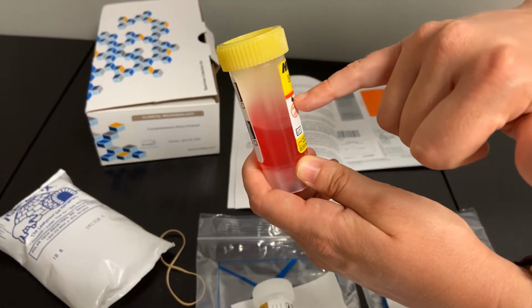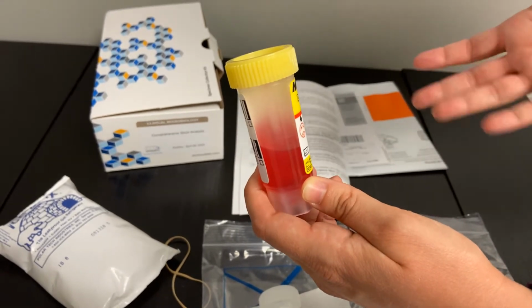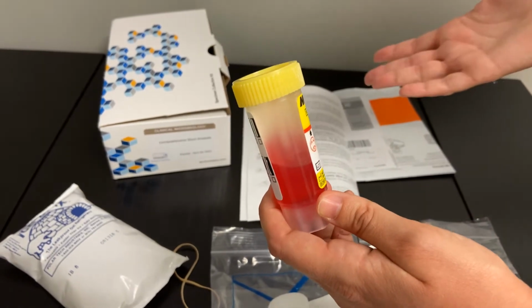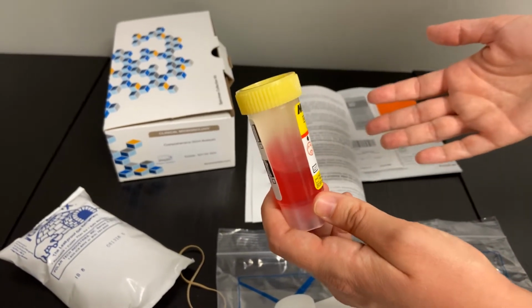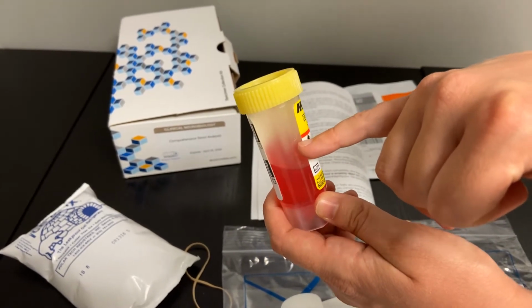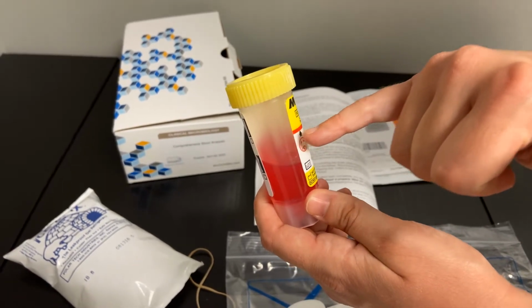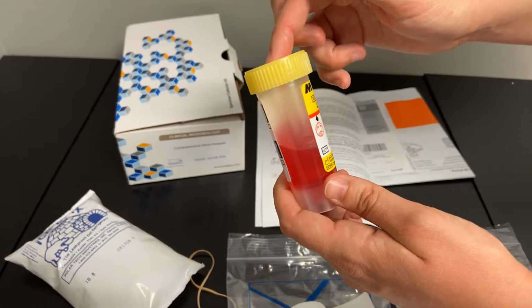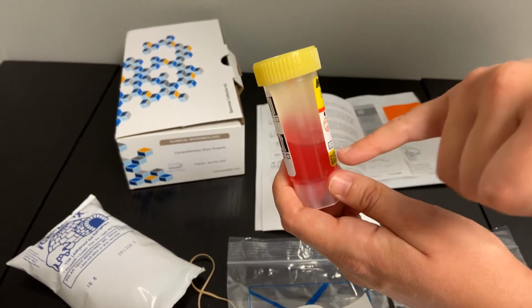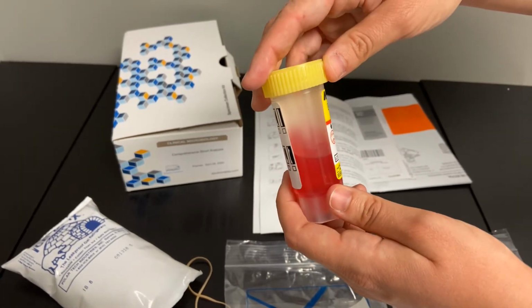We cannot go any higher than this red line because higher than this red line indicates that it's overfilled, and when things are overfilled in transport before it gets to the lab, it might explode, which we certainly don't want to have the lab have to deal with. So make sure that you're filling it just underneath this fill line. If the stool, for whatever reason, does creep up above that red line, make sure that using this spatula, take only the stool out, making sure that all the liquid is maintained within that vial, and then just dispose of that extra stool in there.